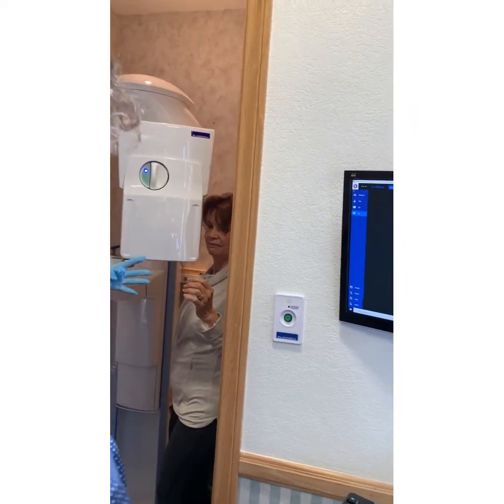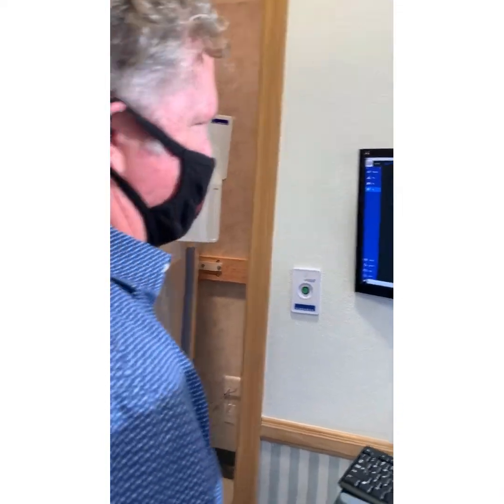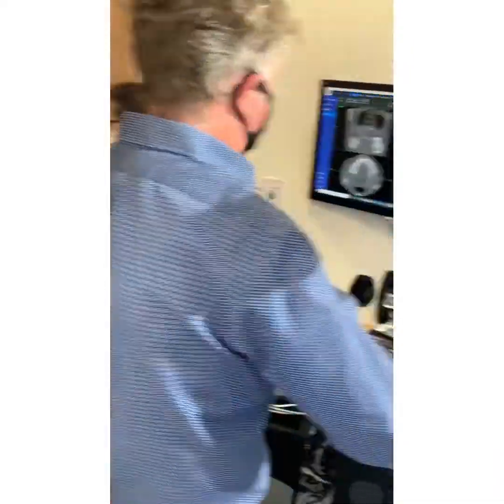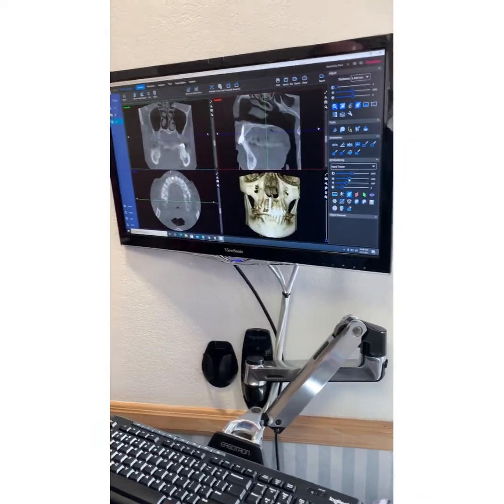See that? This one I'm concerned right here. We're going to get it moved to the left. Just be careful when you step out. Yeah, it's a little tight. Perfect, you got it? Oh wow, that's great. So, once it. Wow, there you go, Pam. There it is. Pretty neat.